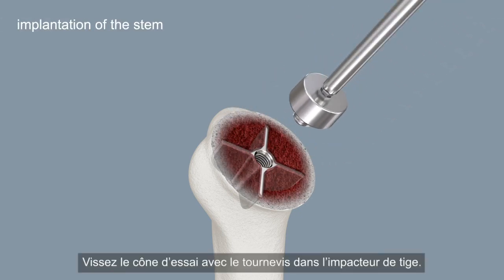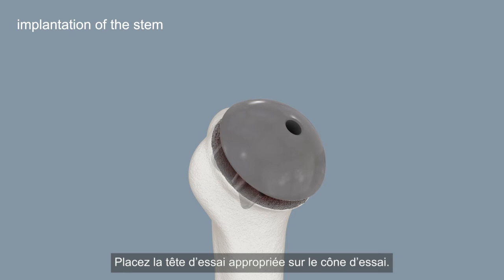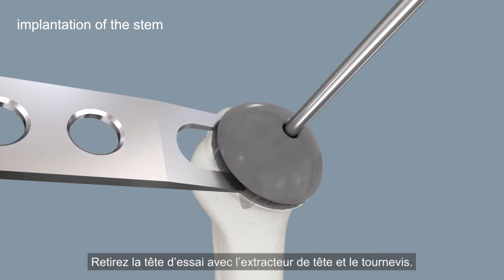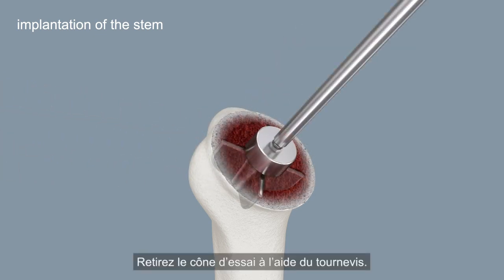The trial cone is screwed into the stem impactor with the screwdriver. Place the appropriate trial head on the trial cone. Remove the trial head with the head extractor and screwdriver. Remove the trial cone with the screwdriver.